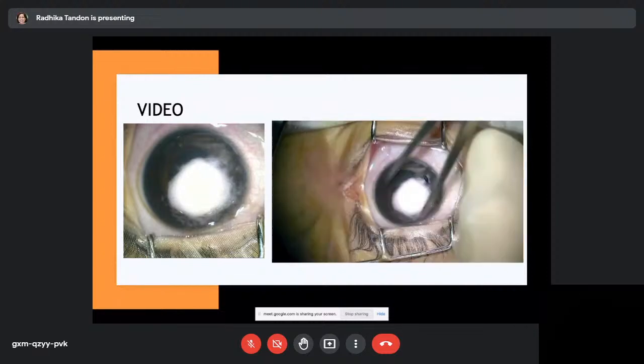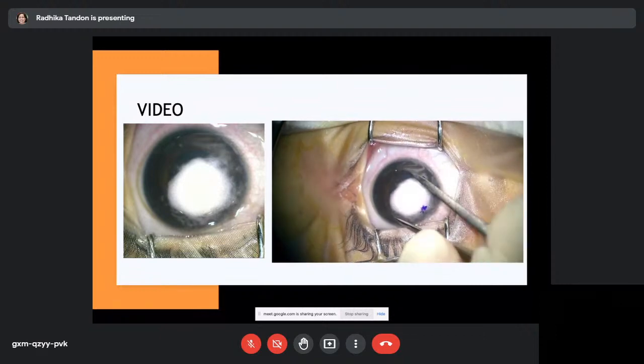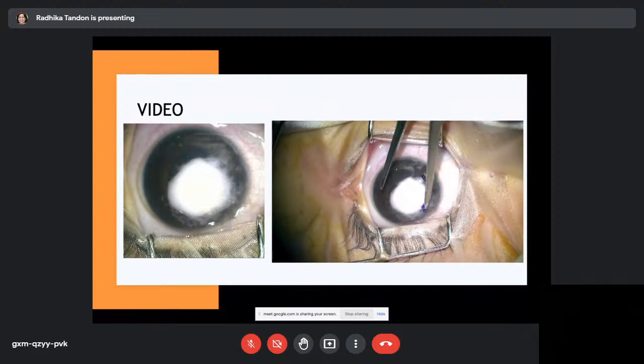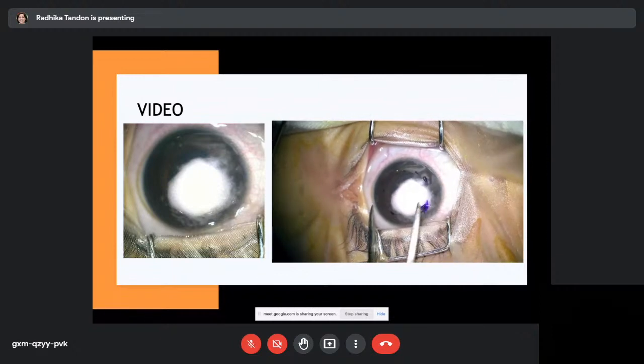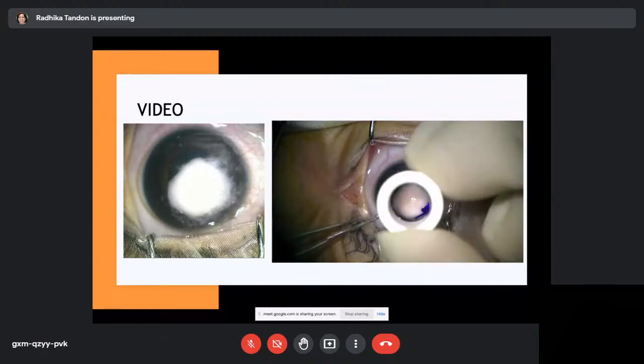In this particular case, as you can see, the lesion is a little off-center, part of it is going quite near the limbus, so we center the area of dissection so that you still remain centered on the visual axis and remove the lesion largely in toto. The aim is not to remove the entire opacity, because if one went for that, one would go too close to the limbus, and that would increase the risk of early loosening of sutures, and of course in the case of PK, a higher risk of endothelial rejection.